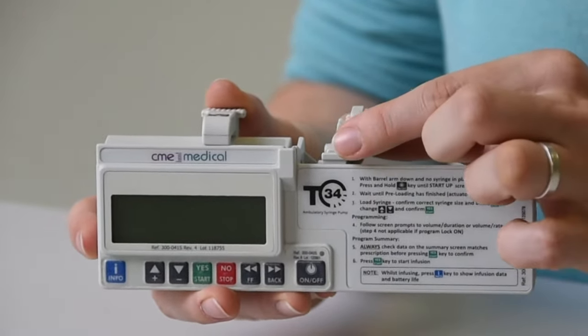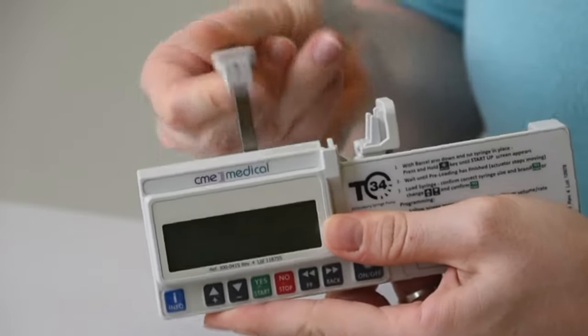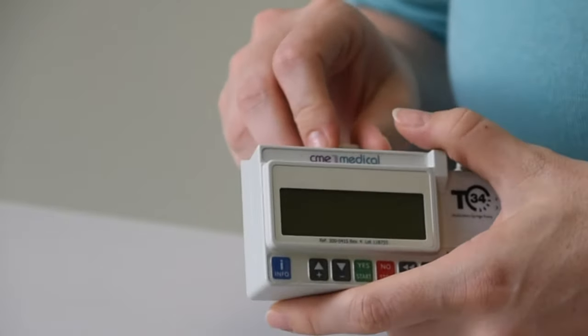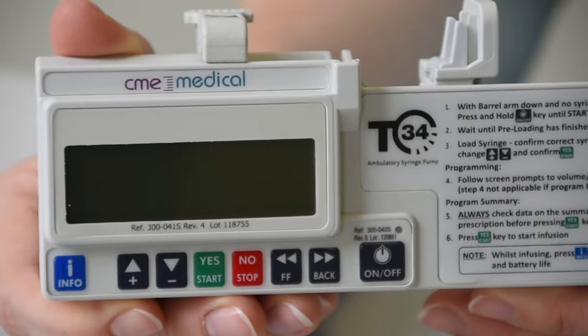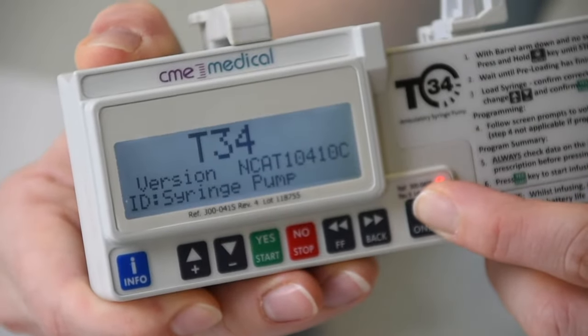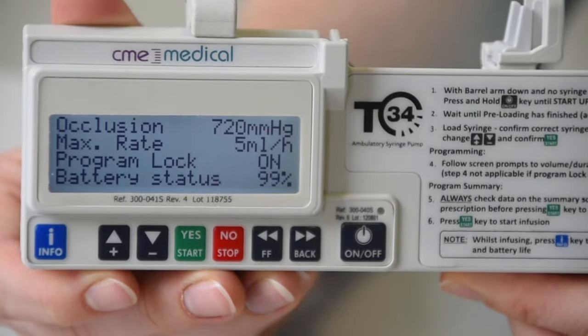There are three detection points: the plunger, collar, and barrel clamp arm. Inspect the syringe pump, ensuring it is clean, undamaged, and the barrel clamp arm is down and battery secure. Turn on the syringe pump. Keep fingers out of the way as the pump does its preloading checks once the machine is turned on.